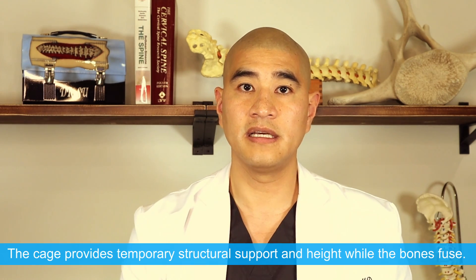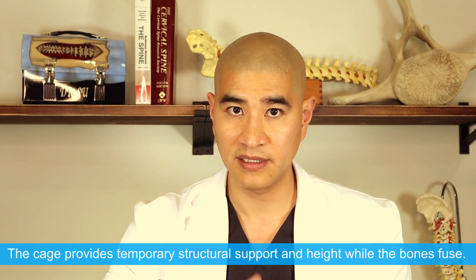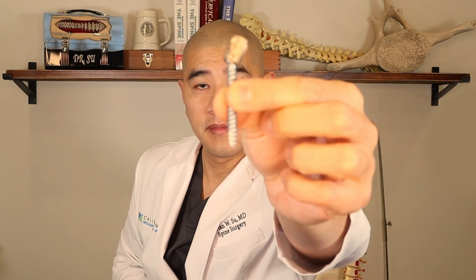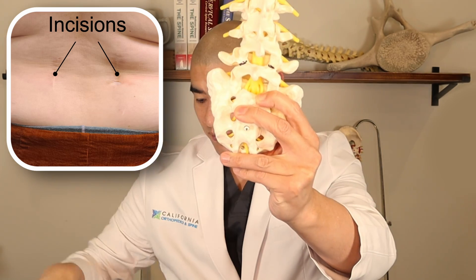The ALIF, LLIF, and TLIF cages are all meant to give structural height to the disc space, with bone graft or BMP inside allowing bone to grow across. Almost all interbody fusion techniques require the placement of pedicle screws to hold the bone stable so that bone can grow across the cage. These screws are placed from back to front, which means for an ALIF or LLIF we have to position you face down with your back up. In the setting of indirect decompression, pedicle screws are typically placed in a minimally invasive manner, requiring two incisions on either side of the spine just off midline.